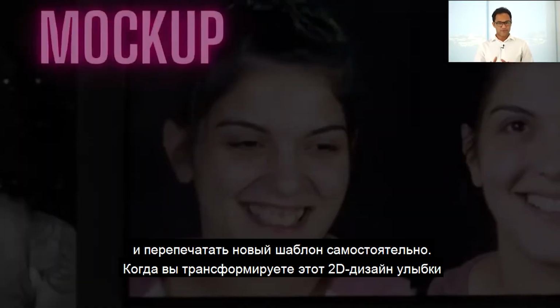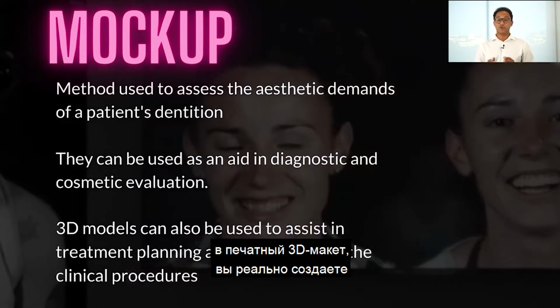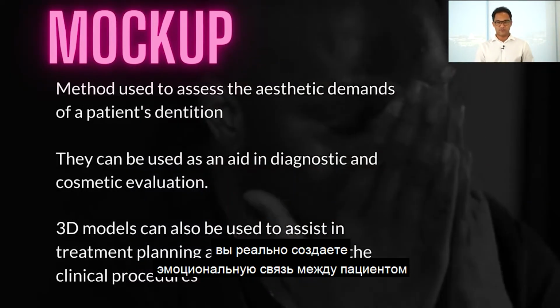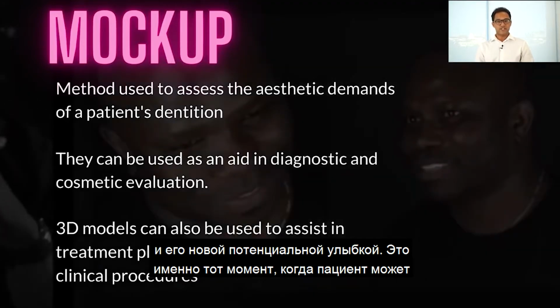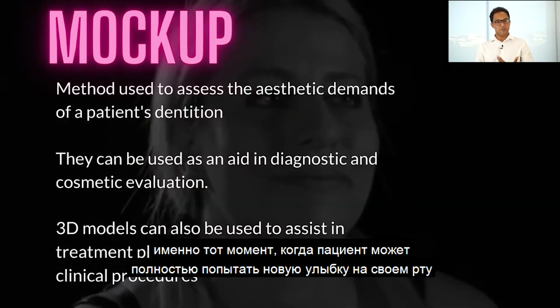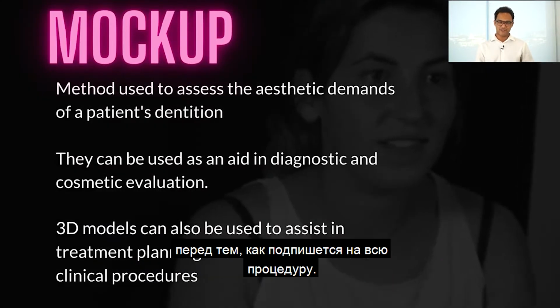When you transform that 2D smile design into a 3D printed mockup, you truly create an emotional connection for your patient and their new potential smile. That's where your patient can fully experience their new smile in their mouth before committing to a permanent procedure.